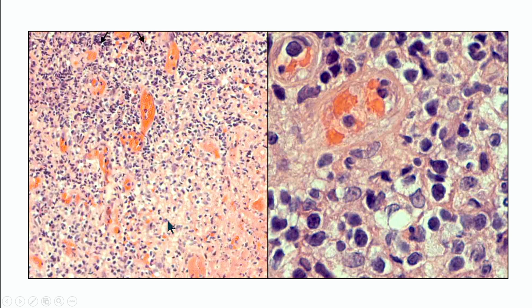And the histopathology is actually not all that informative, although it is striking. There's a rich influx of lymphocytes and histiocytes, which we see here. There's a little bit of necrosis that's patchy, but nothing really diagnostic even after multiple rounds of culture, multiple biopsies, the whole panoply of special stains for microorganisms in the anatomic pathology lab.